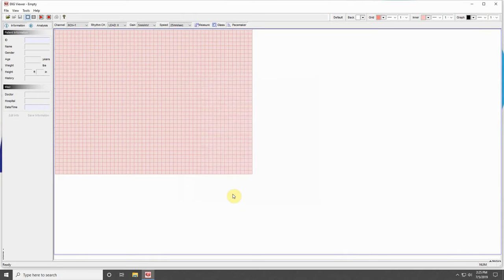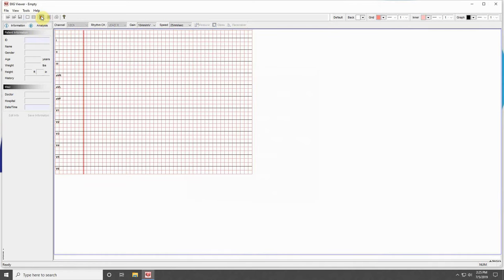Press OK at the bottom of the window to exit settings. Press the red Play button on your EKG viewer program, and a red bar should begin scrolling to the right. This indicates that your computer is connected to your machine. Congratulations!